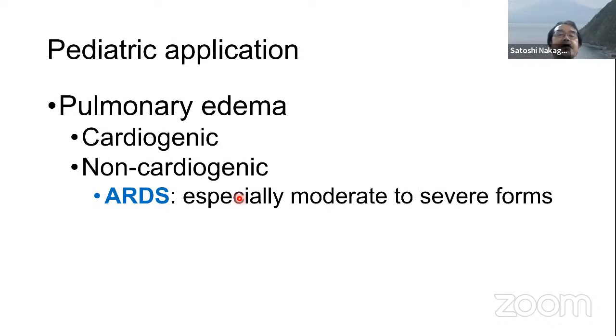The major pediatric application of high-frequency oscillation is in pulmonary edema, either cardiogenic or non-cardiogenic. A typical non-cardiogenic pulmonary edema is ARDS, as you know. Especially the moderate to severe form of ARDS is going to be the indication for high-frequency oscillation.